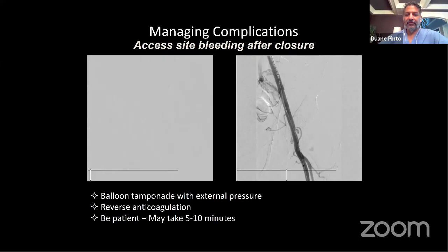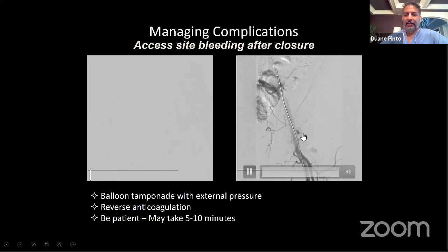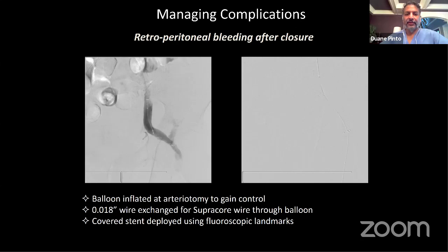Again, another depiction of balloon tamponade. See a small amount of bleeding here. And again, this is where you'll want to compress so that this ooze stops and doesn't turn into a pseudoaneurysm.